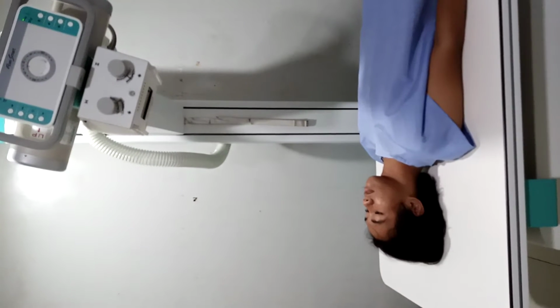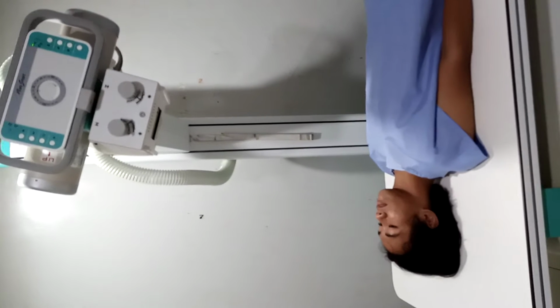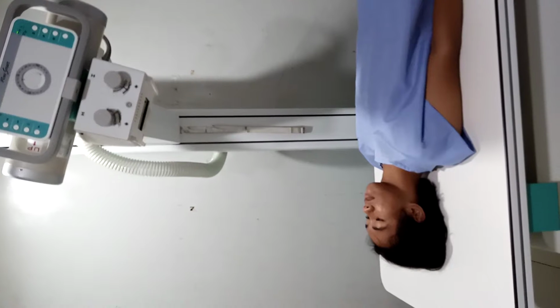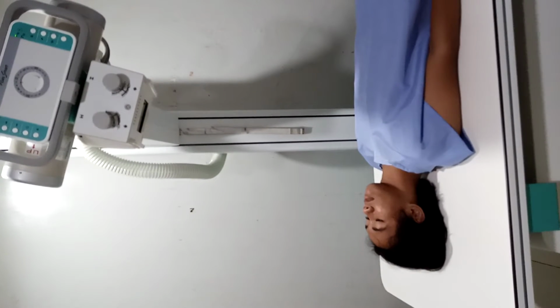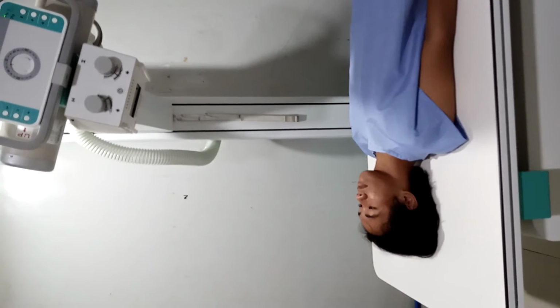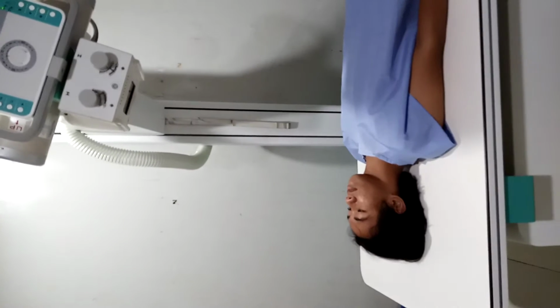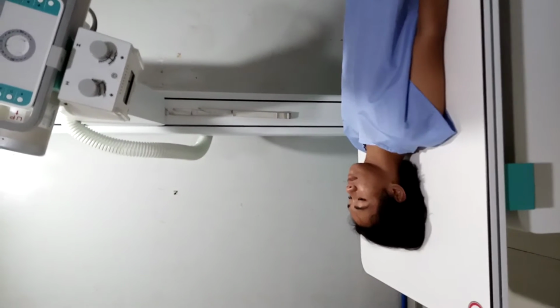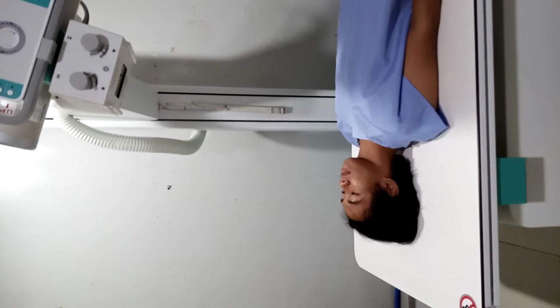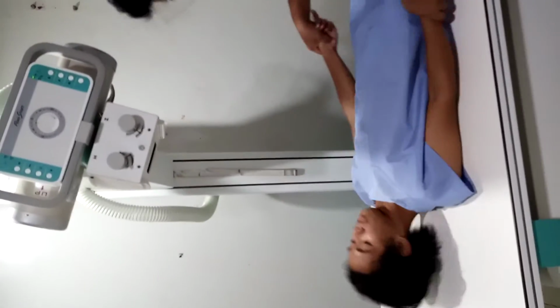The next position is cervical vertebrae in lateral projection or lateral position, what we call the Grandy method. Again, in patient positioning, the patient must be positioned supine, or standing in lateral position, or seated. In this position, we need to instruct the patient to stand.